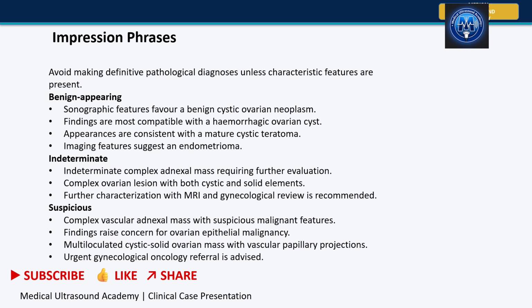Suspicious complex vascular adnexal mass with suspicious malignant features. Findings raise concern for ovarian epithelial malignancy, multilocular cystic-solid ovarian mass with vascular papillary projections. Urgent gynecological oncology referral is advised.